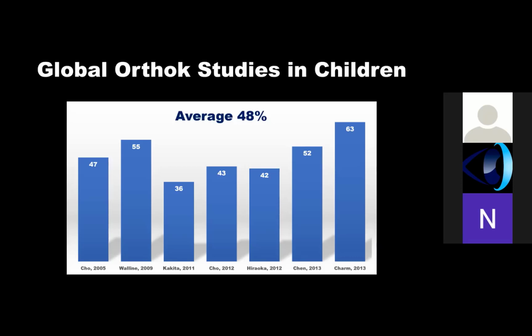And then we have those who actually don't progress at all. And to really understand what the variation in that growth is in the control group, you have to look at those deviations, either the standard deviation or the standard error, to understand that. But I think it's pretty safe to say across the board, variable responses.